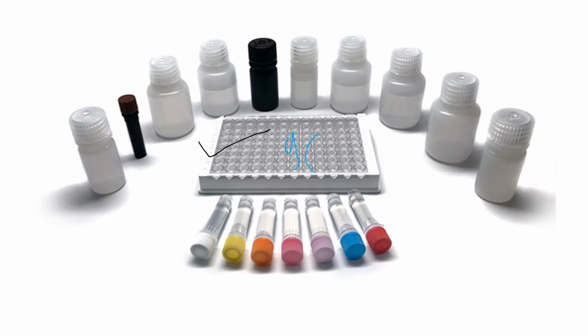Here you have 96 wells, and different bottles: the bottle for the enzyme conjugate, the bottle for the wash buffers. Here we are using some standards, everything which is provided in the ELISA kit. So let's start with the ELISA.